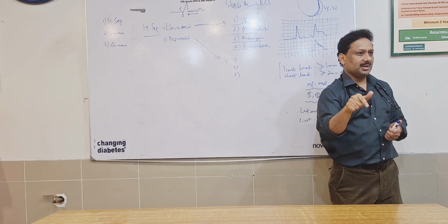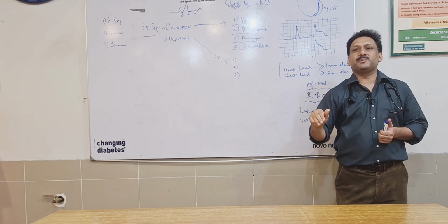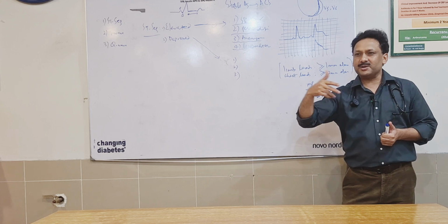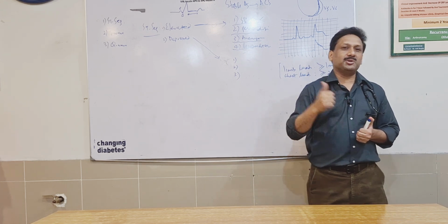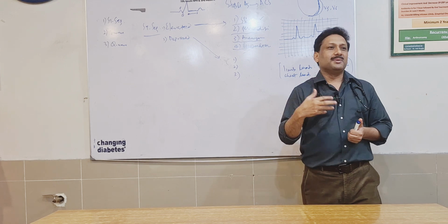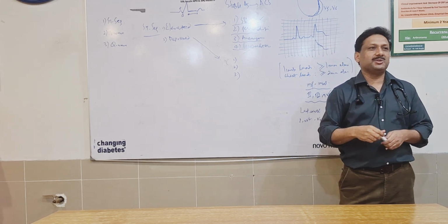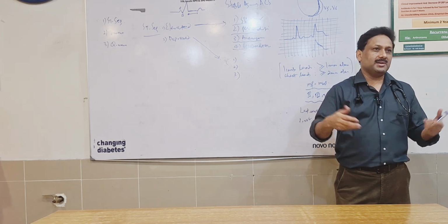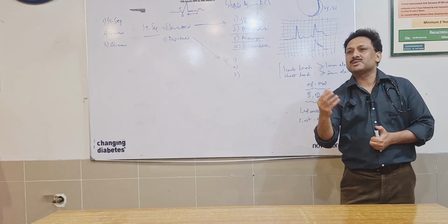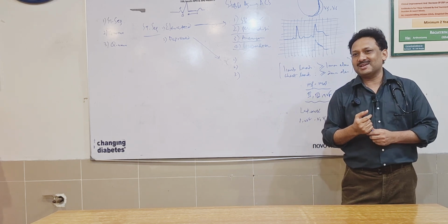How would you come to know that this is not myocardial infarction, this is Prinzmetal angina? The changes keep coming and going. I remember a case I saw in casualty around 17, 18 years back. We were not very well aware of that picture, and the senior was not there. However, we did call and started talking to him when we saw something unusual. We were preparing the streptokinase injection, SK injection.